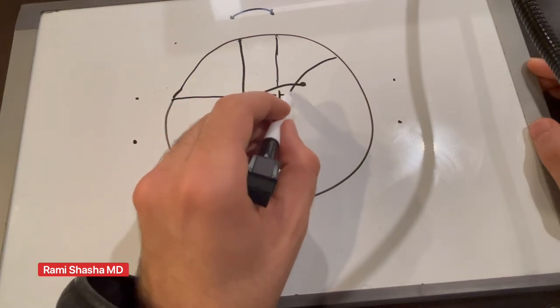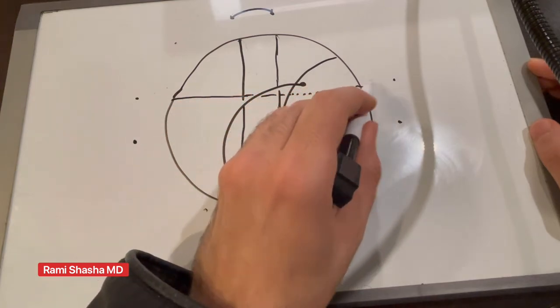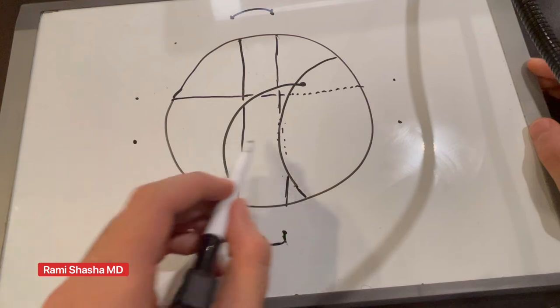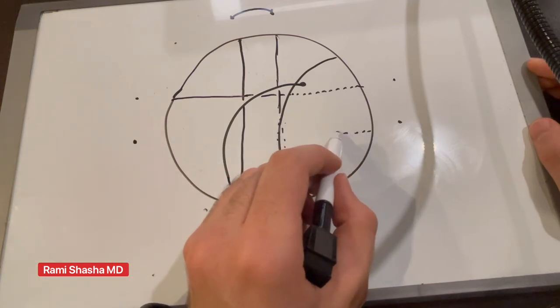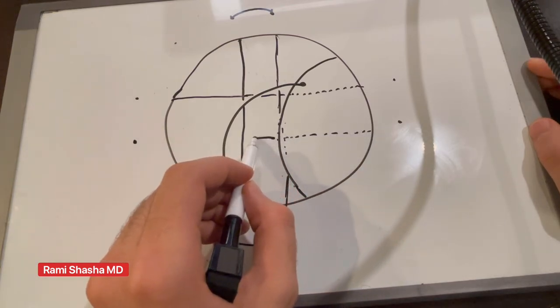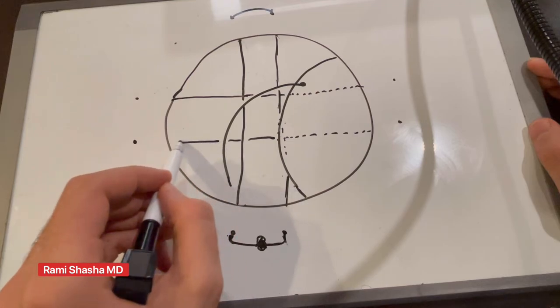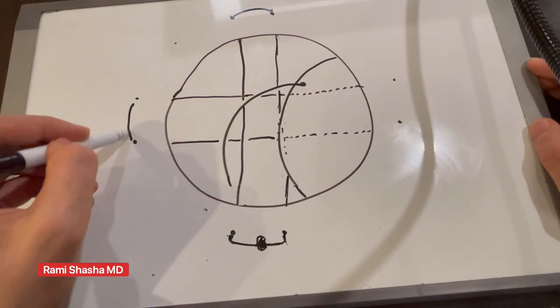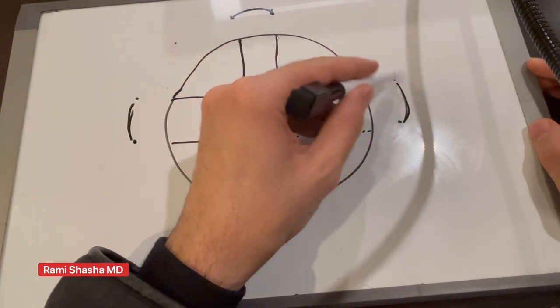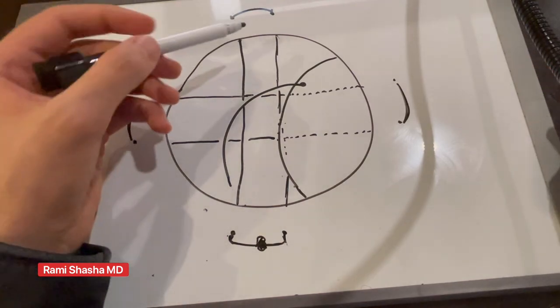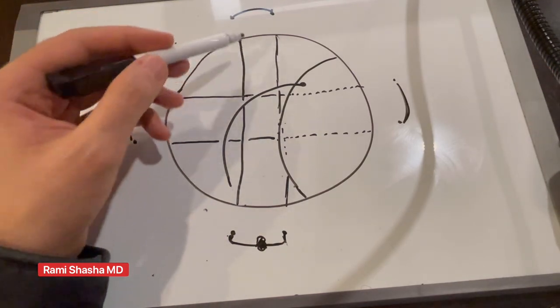You'll be left with sutures like that, and so now you've got a real backboard, you've got great support.